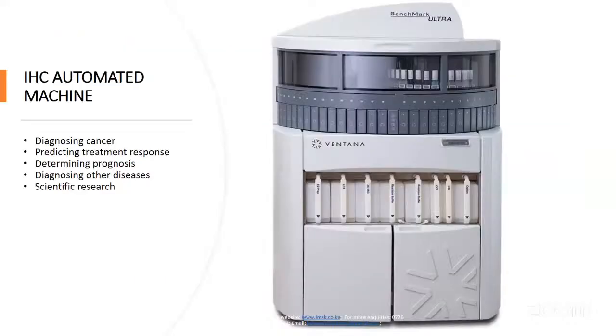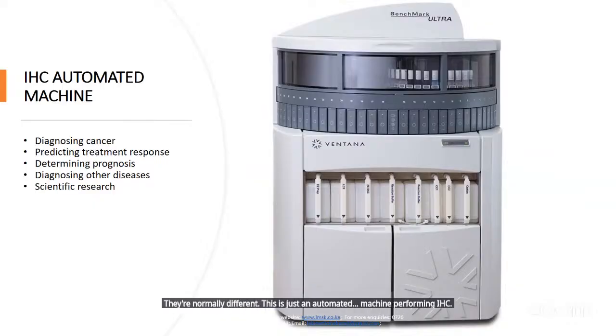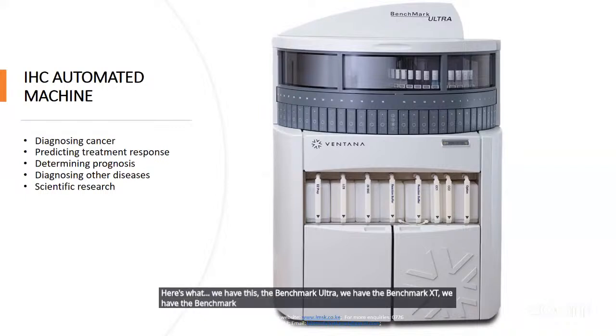This is just an automated machine performing IHC. We have the Benchmark Ultra, the Benchmark XT, and the Benchmark Ultra Plus. They are different models.